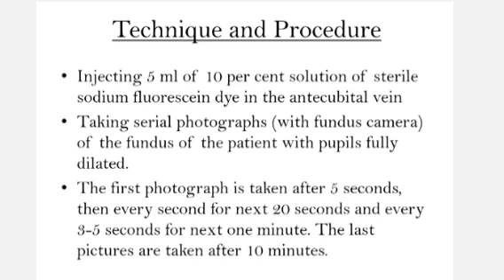The first photograph is taken after 5 seconds. So friends, please confirm this: the first photograph is taken after 5 seconds, then every second for the next 20 seconds, and every 3 to 5 seconds for the next 1 minute. The last pictures are taken after 10 minutes. So these are the timings for taking photographs with the help of the fundus camera.